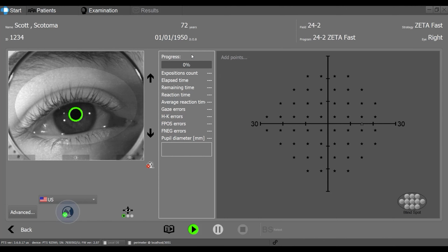The voice command button can be used to toggle vocal software announcements on and off. When on, a drop-down menu above provides an assortment of languages to select from. Gaze tracking toggle can be adjusted to 3 distinct star levels, ranging from 1 to 3. 1 star is the default level and will monitor the patient fixation by periodically testing the plotted blind spot. This replicates the fixation monitoring method utilized by the Humphrey Field Analyzer.